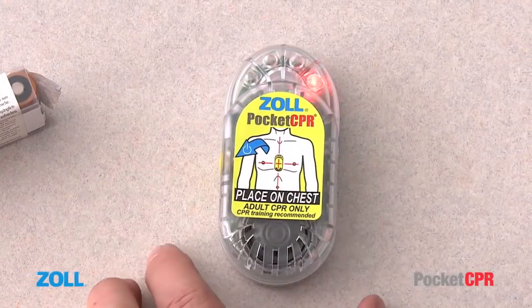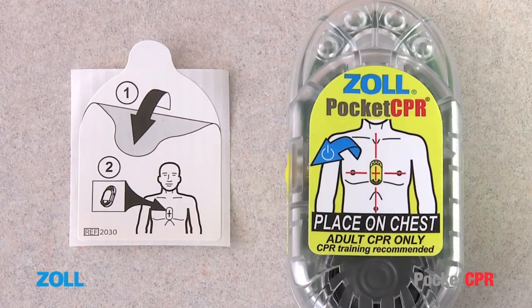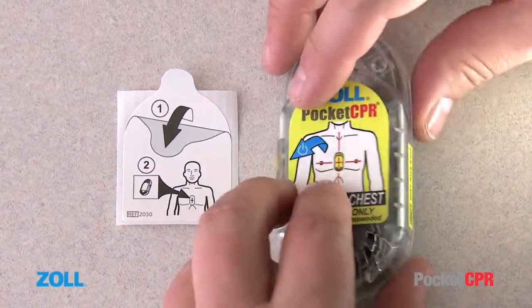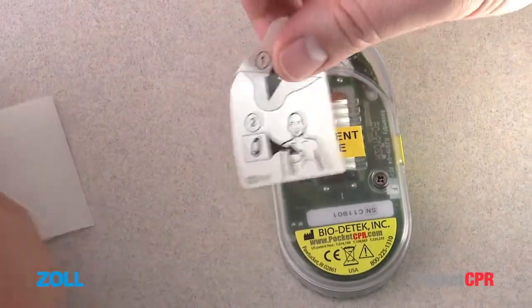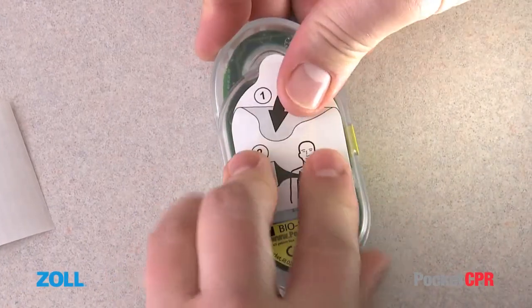Stay calm. Check responsiveness. The PocketCPR can be adhered to a mannequin or a patient, using the adhesive label accessory made for this purpose. Remove the backing paper from the adhesive label. Apply the label to the back of the PocketCPR and press firmly to secure it.